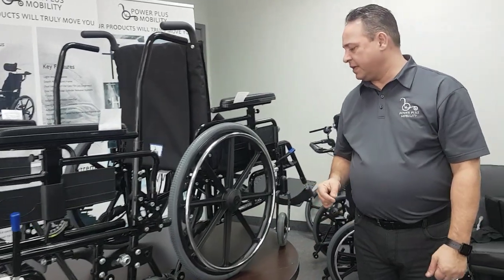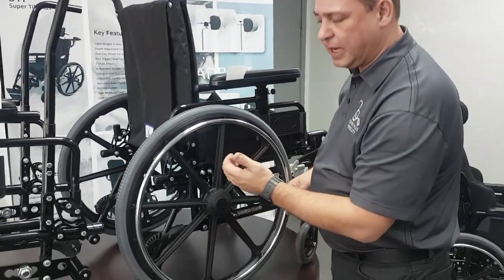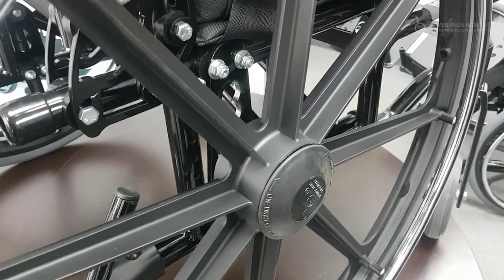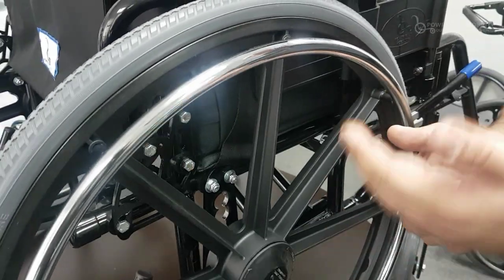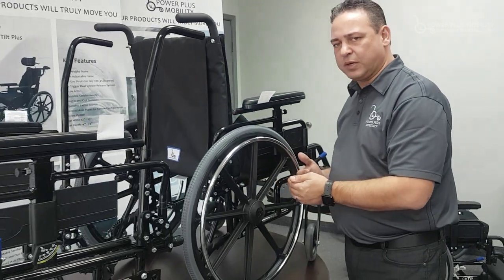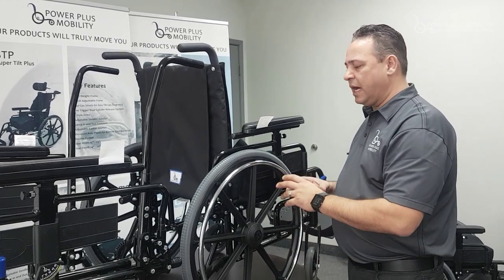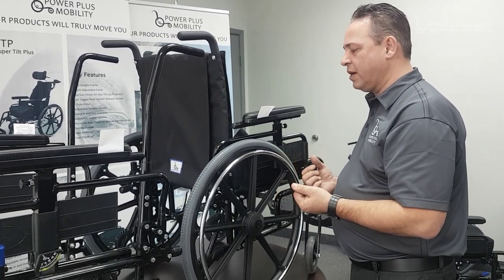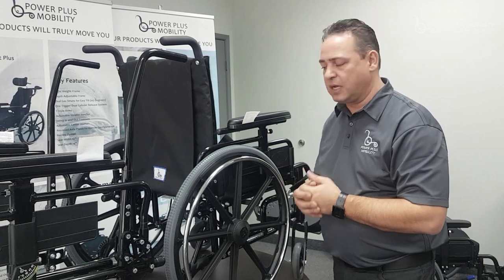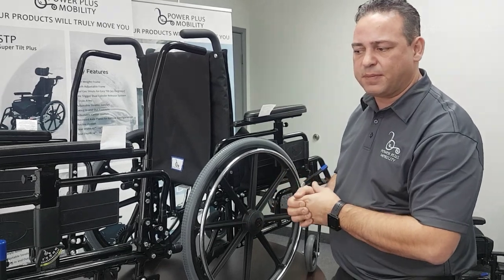Our third axle plate is on our Type 3 chair, the Magic Plus. It is a vertical axle plate and you can see how the wheel is mounted on the unit. By having vertical adjustability, we have a greater range of depth adjustability, forward adjustability along the frame, and height adjustability. Greater adjustability allows for a finer-tuned chair to accommodate the end user's hand propelling needs and seat-to-floor height needs for foot propulsion. Those are our three types of axle plates — thank you very much.